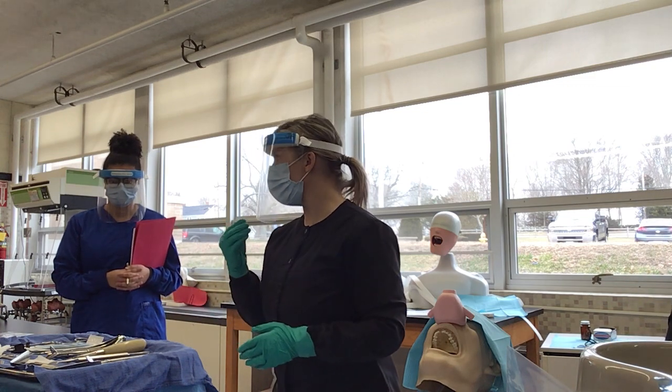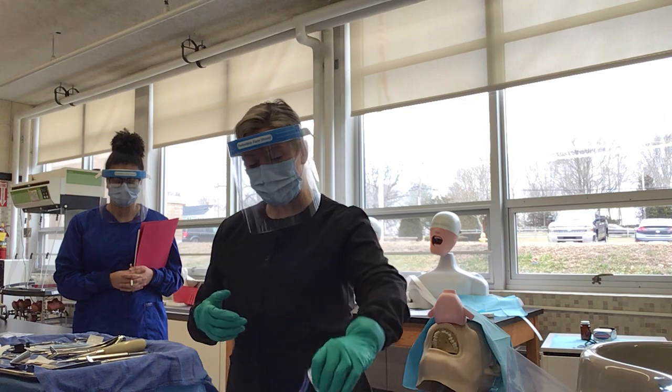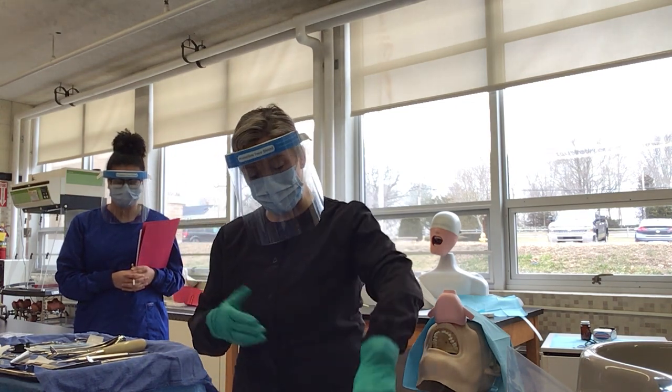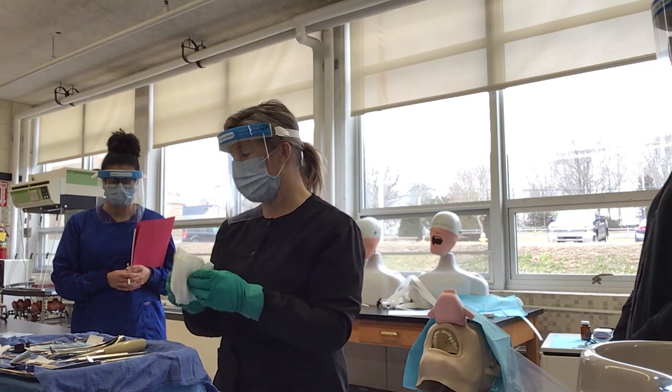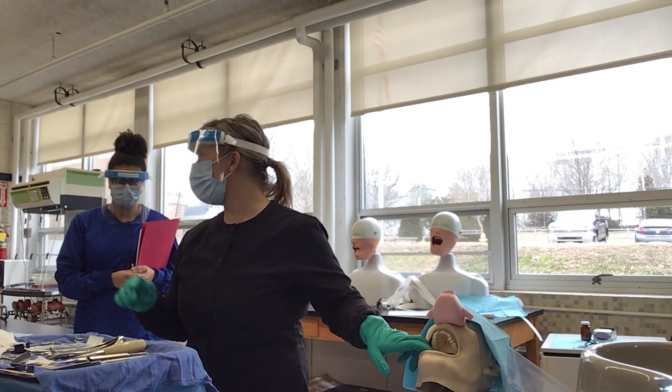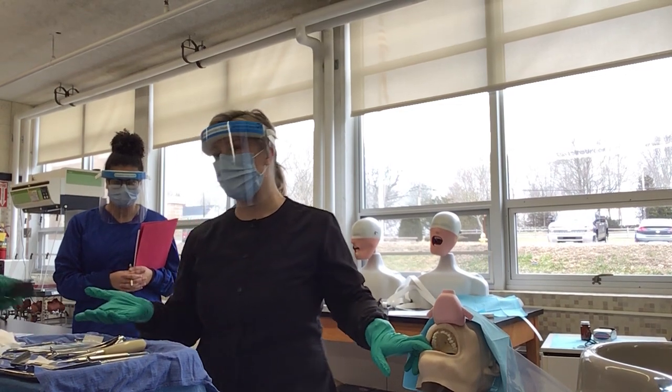So we're going to put a 4x4 or a larger piece of gauze. This one has the handle, so it could be pulled out, so that we could put in what's called a throat pack, okay? So he is starting to get sleepy, so before he gets too sleepy on us, I'm going to ask for the bite block.